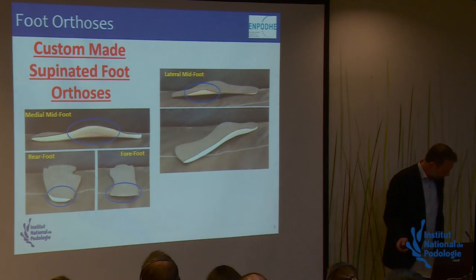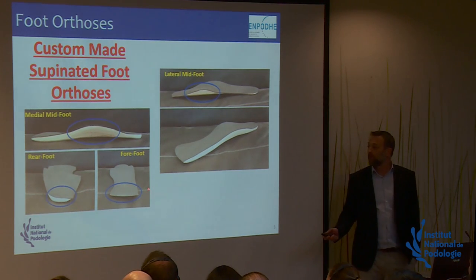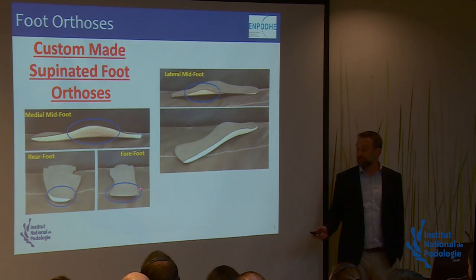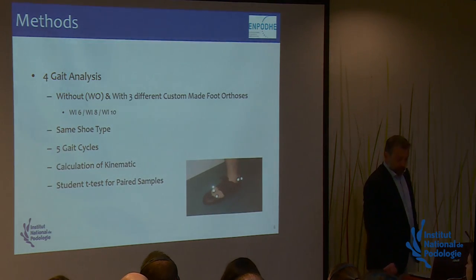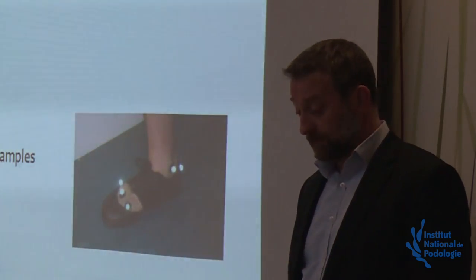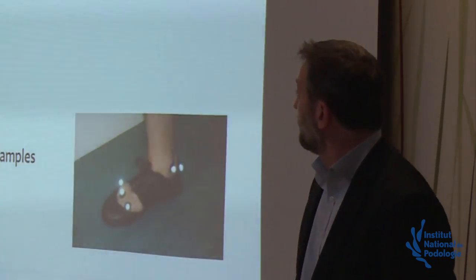So in my study, I chose to have different forefoot slopes. It means different heights under the first metatarsal head. I used 6 millimeters, 8 millimeters, and 10 millimeters, just to see what will happen at the ankle. So we made a gait analysis without orthosis and with three custom-made foot orthoses, like I said, with 6 millimeters, 8 millimeters, and 10 millimeters.